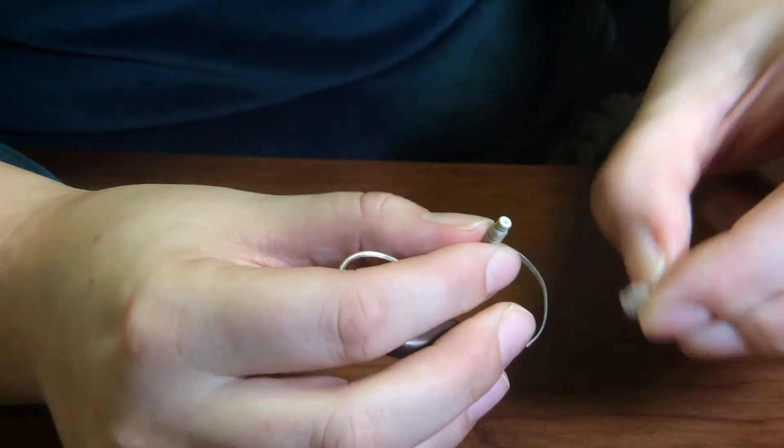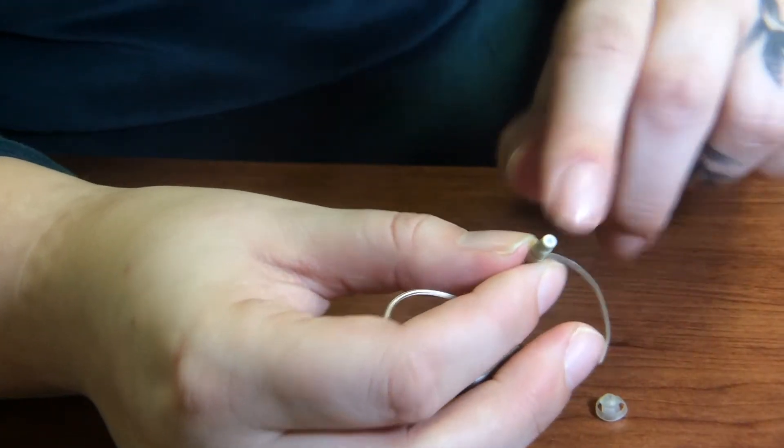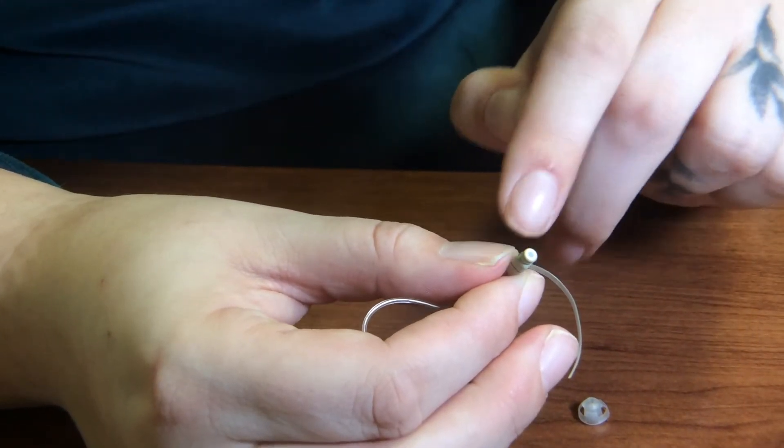And then you want to take the dome off. Most of them are grip tip style and they just connect towards the bottom of the hearing aid.